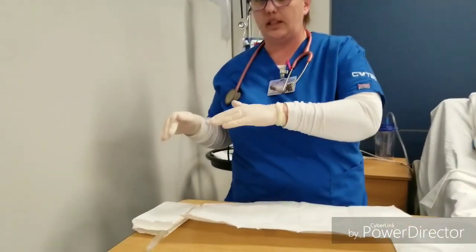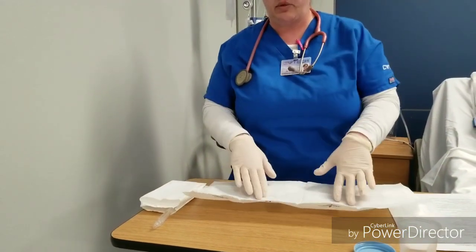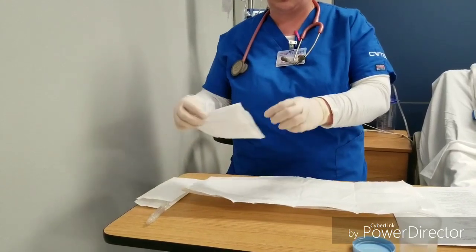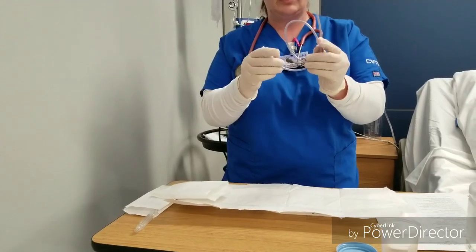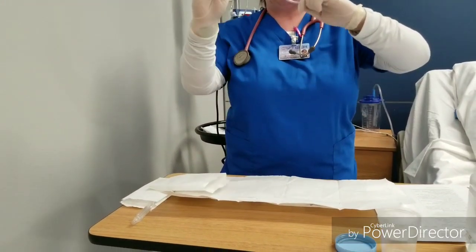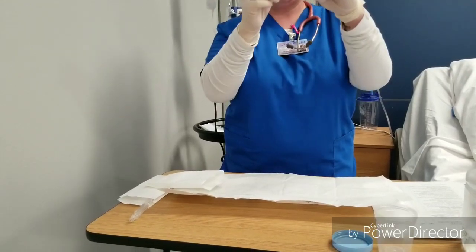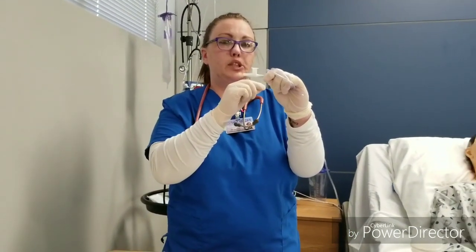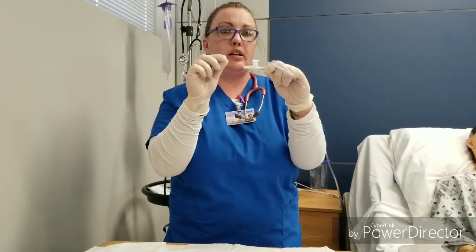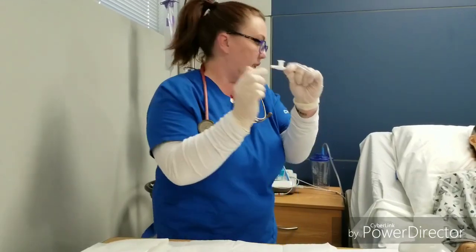And for this is obviously not sterile, but you would open a new package before opening your gloves and it would all be sterile. And right now, all of this is sterile, so I'm going to loop this around my dominant hand. And this part is going to attach to the suctioning on the wall that you had previously turned on, and you want it on 80 to 120 and continuous. So I'm going to attach that onto here.